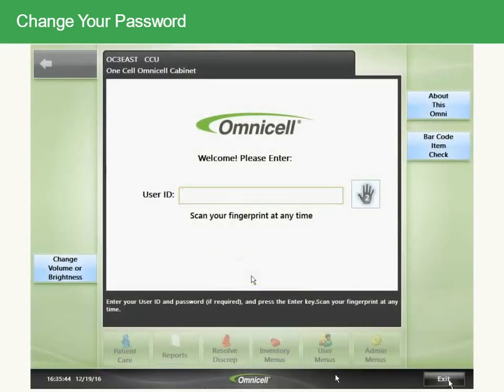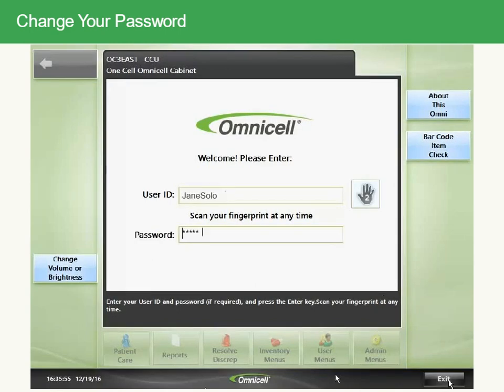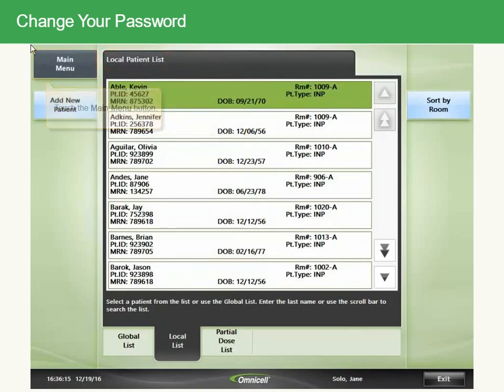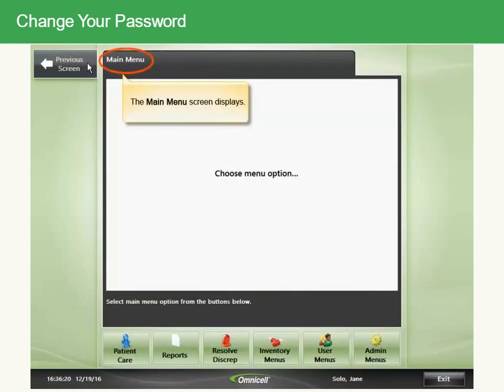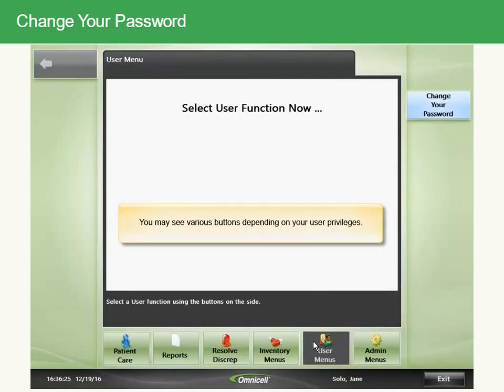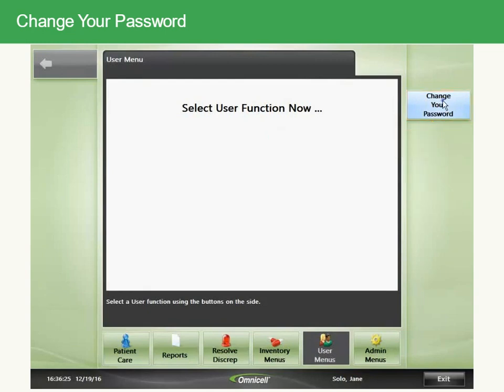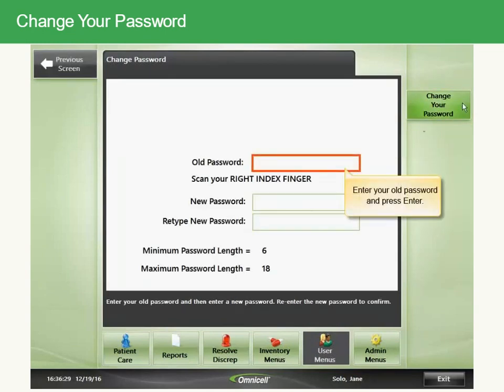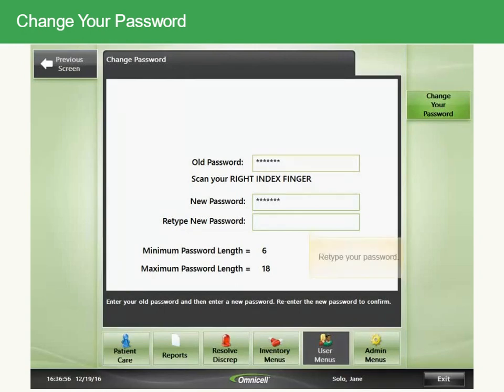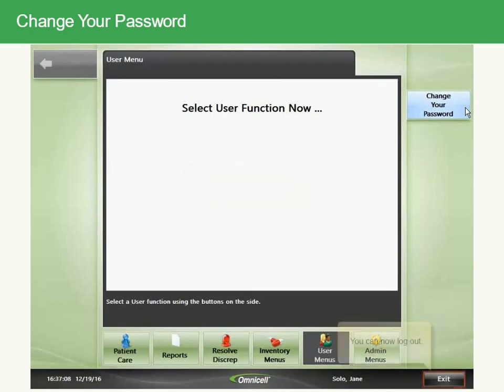Log in to the system. The patient list displays. Touch the Main Menu button, then select User Menus. Touch the Change Your Password button. Enter your old password and press Enter, then enter your new password and press Enter. Retype your password and touch the Change Your Password button. Your password has been changed. You can now log out.